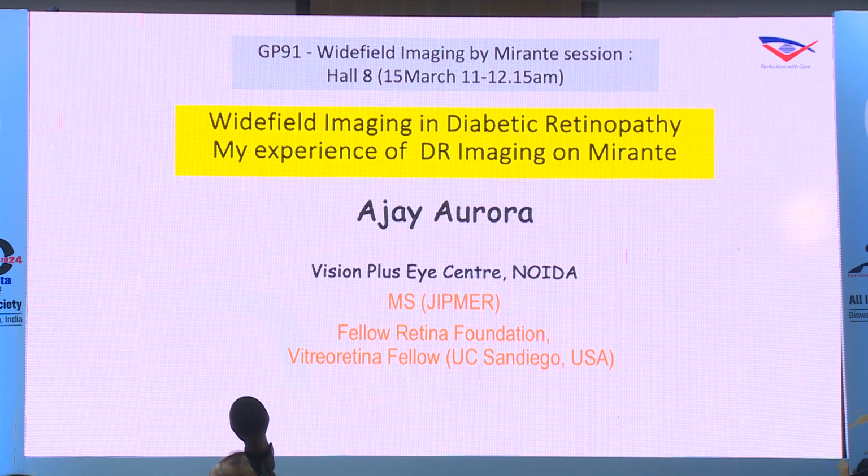I have kept my old fundus camera with me, but there is a scale below on the Mirante where you can adjust the colors. When you adjust those colors near to what you would get in a normal fundus photograph, you have to do it initially, and once you do it initially, all subsequent photographs with the same color combination would come out the same. So that is the only trick which is useful.